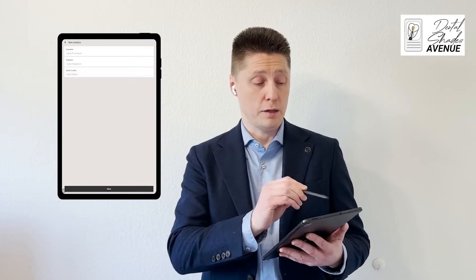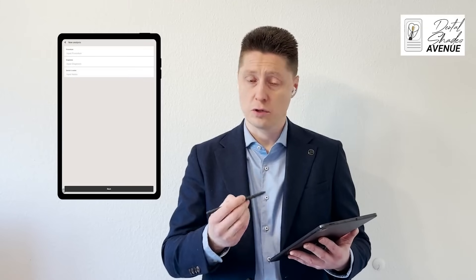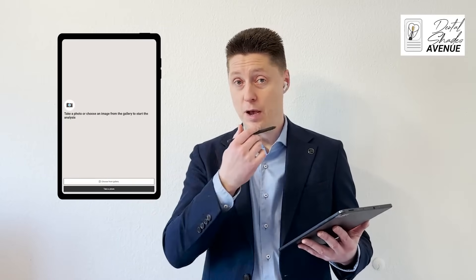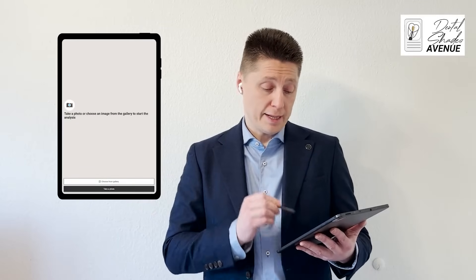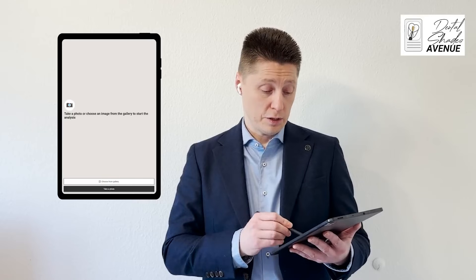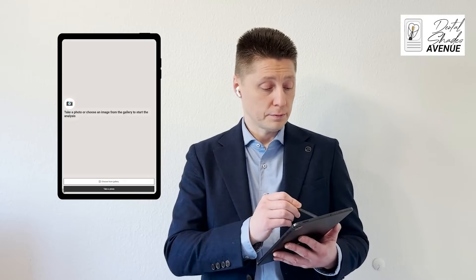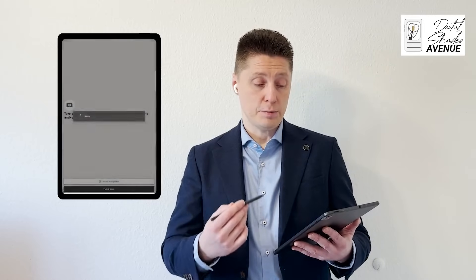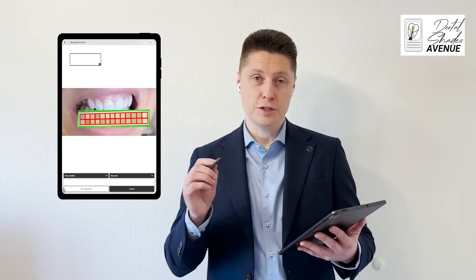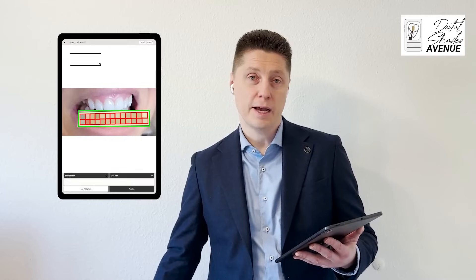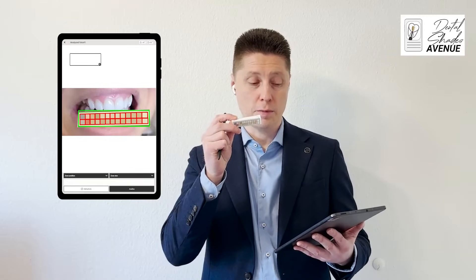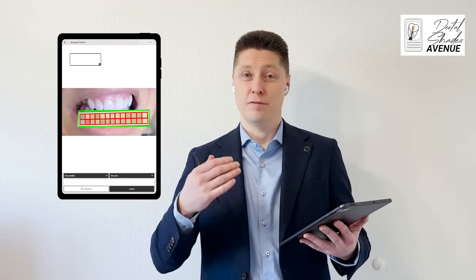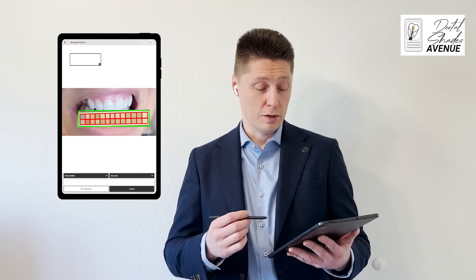We have the possibilities to add the procedure, diagnosis, and doctor's notes, and now already we can start taking a picture of the patient's mouth. We will select in this case the picture that was already done from the gallery. When you see this picture appears in the application, you see that the color master is detected automatically by the application. This color master will be used to have the measurement very accurate to the standards in the local market.